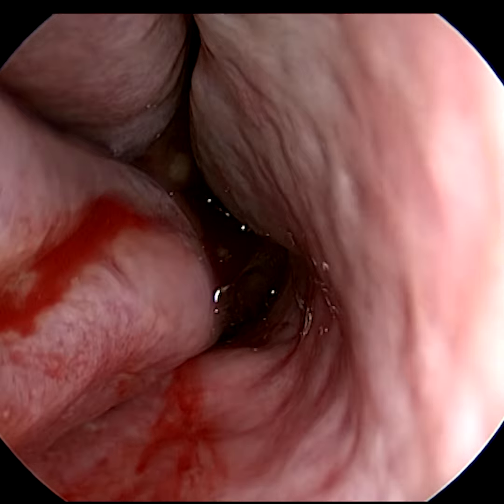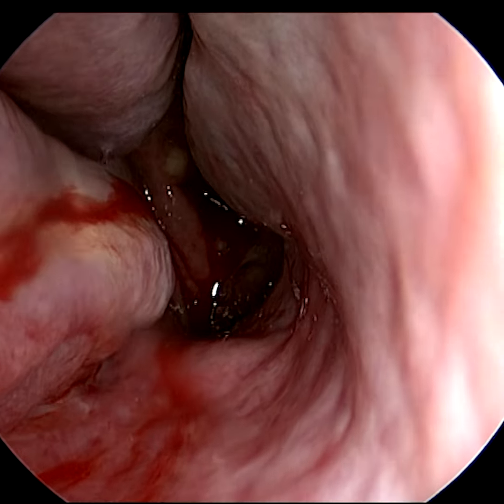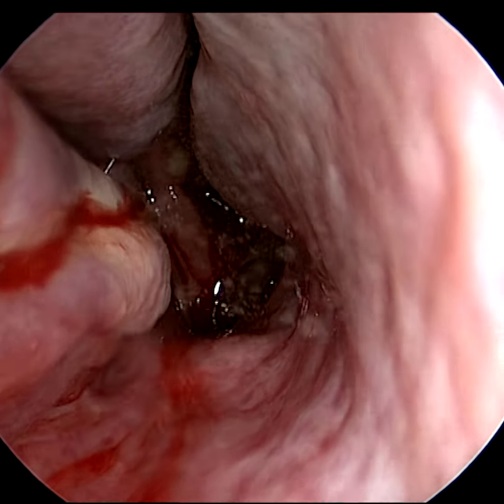You can see at the back of the nose you can be a little bit more aggressive with that area, which is what we call the mulberry end, and really shrink this down completely.